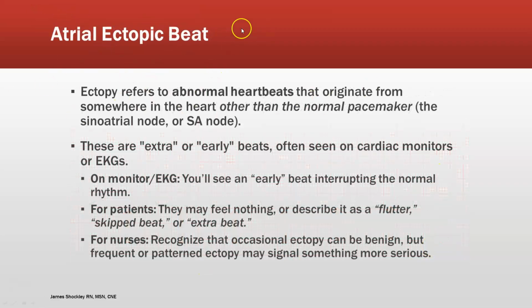So we also understand that if I have this PQRST and it comes early and I have this compensatory pause, that's going to be an ectopic beat. And remember when we talked about our PACs, our premature atrial contractions, which are the ectopic beat, we said that you have to have that compensatory pause. It has to come early. They're extra beats, so that signal is generating from somewhere other than the SA node. And when I say somewhere other than, we're going to be very specific.